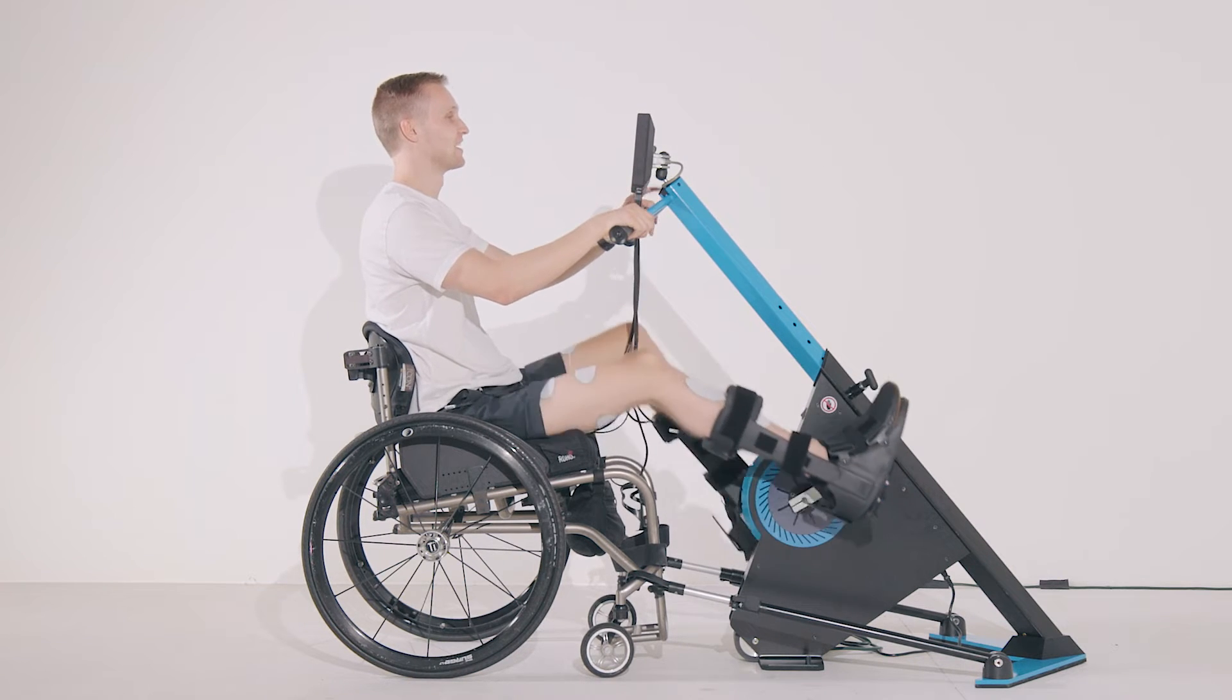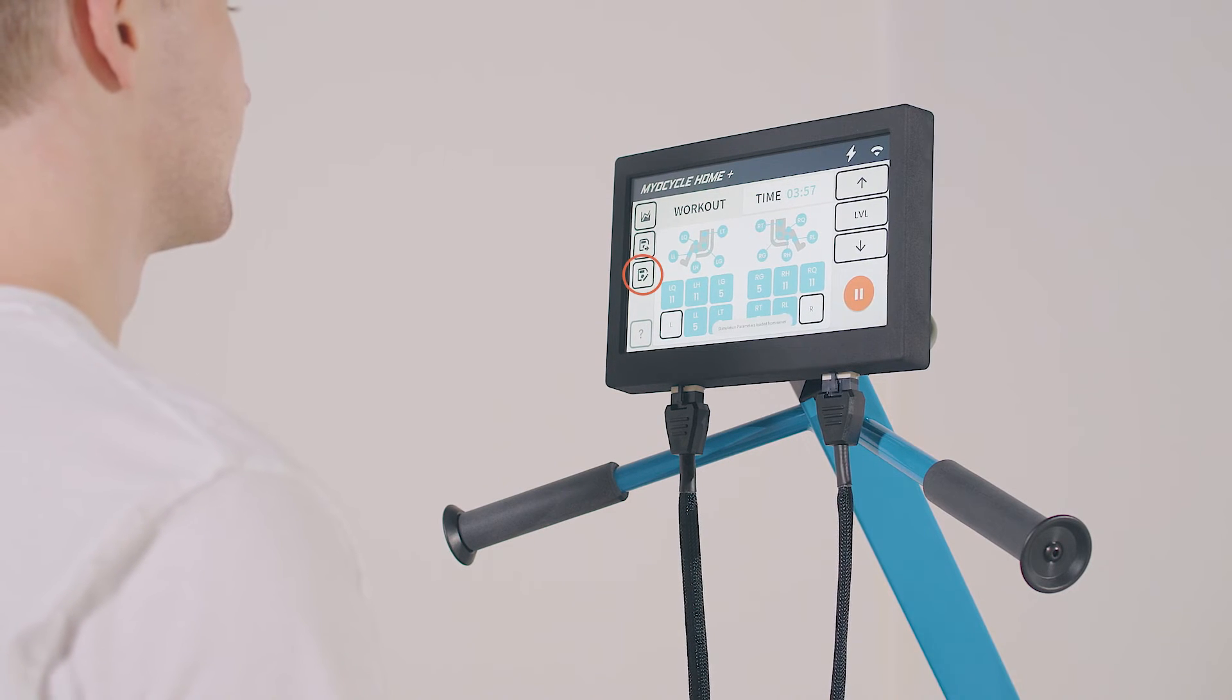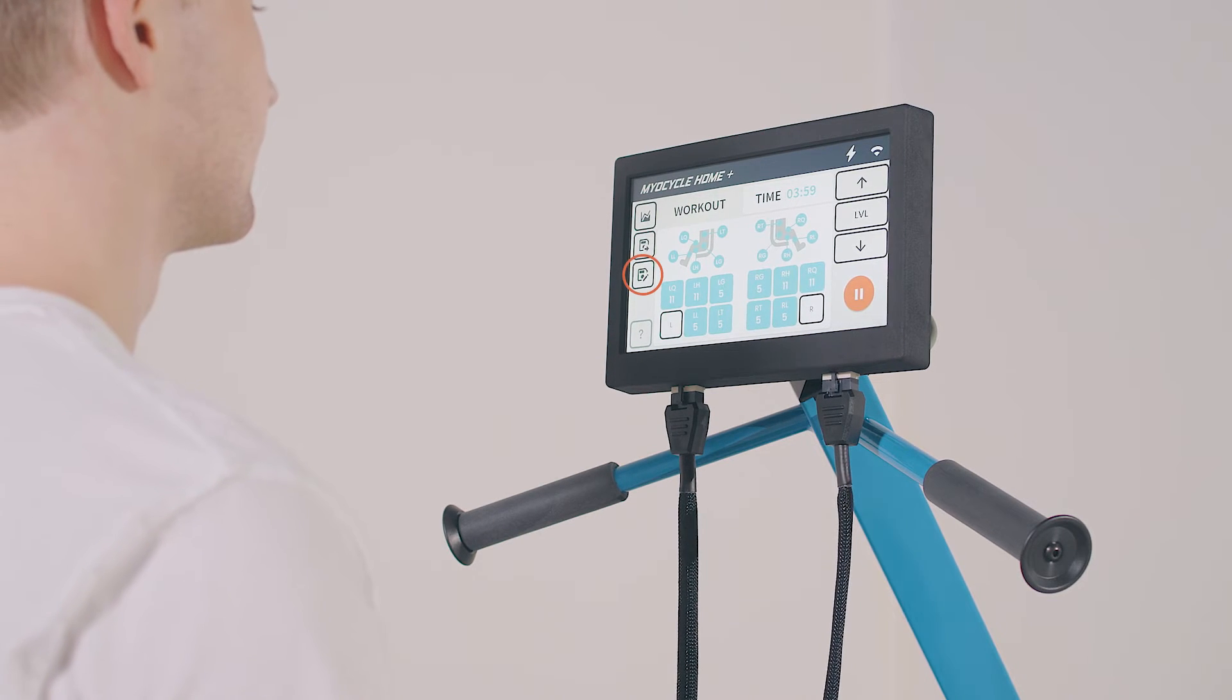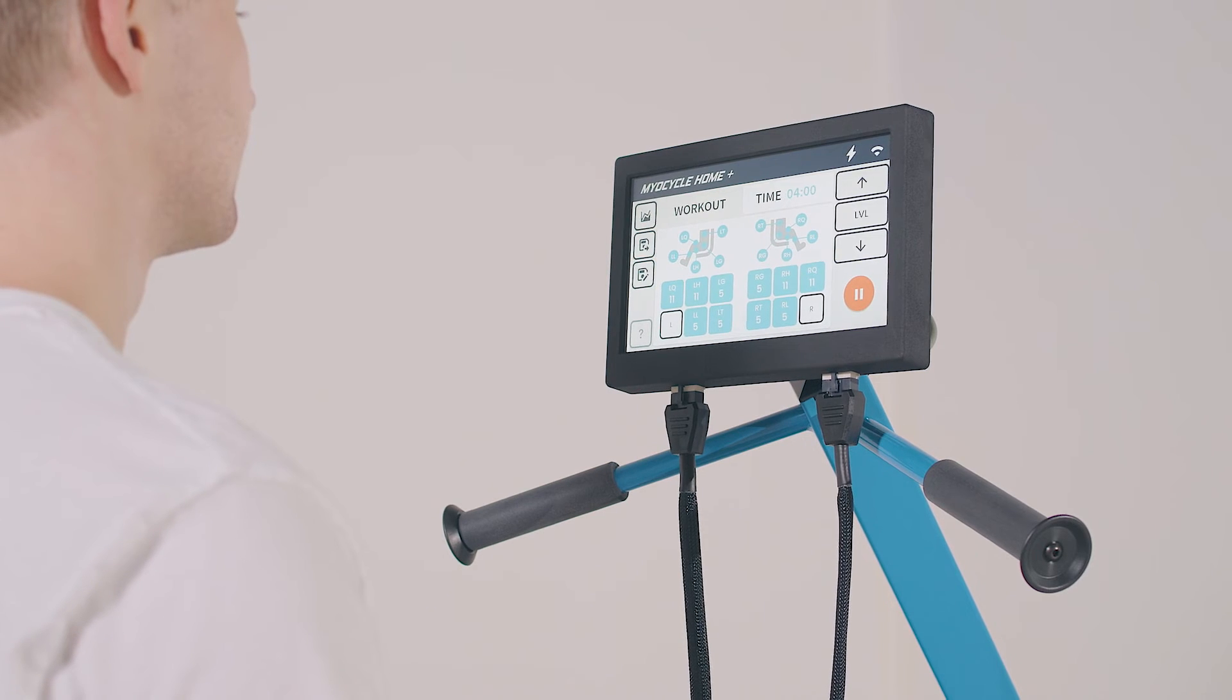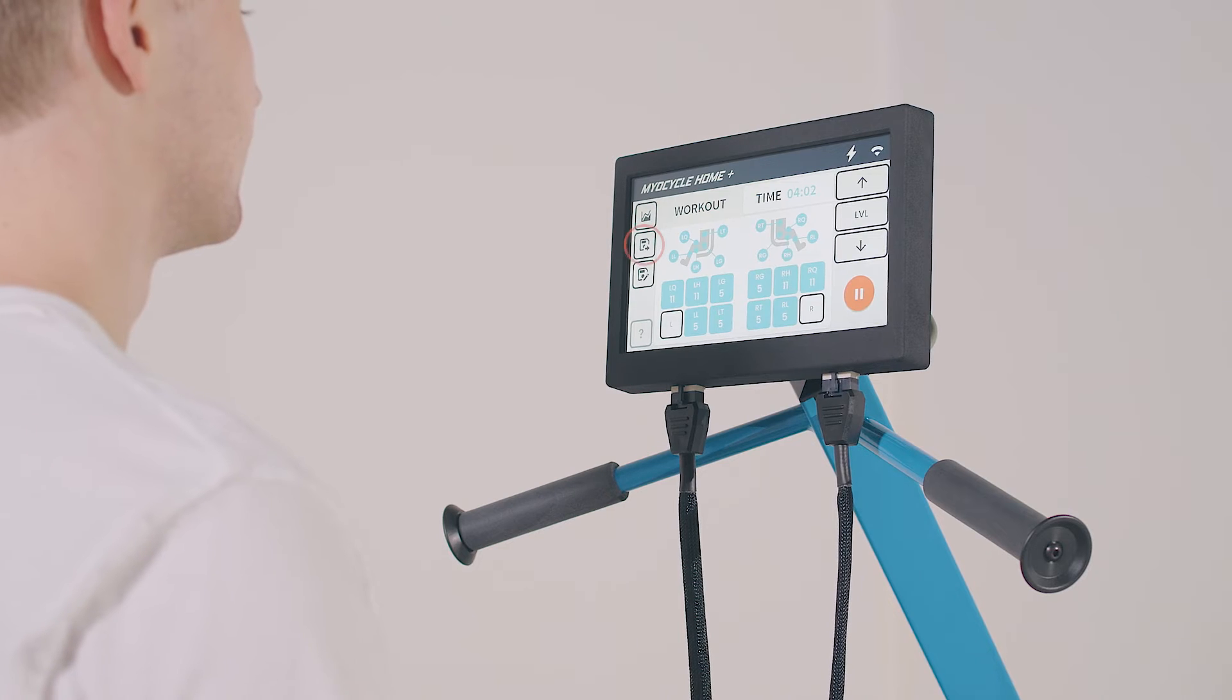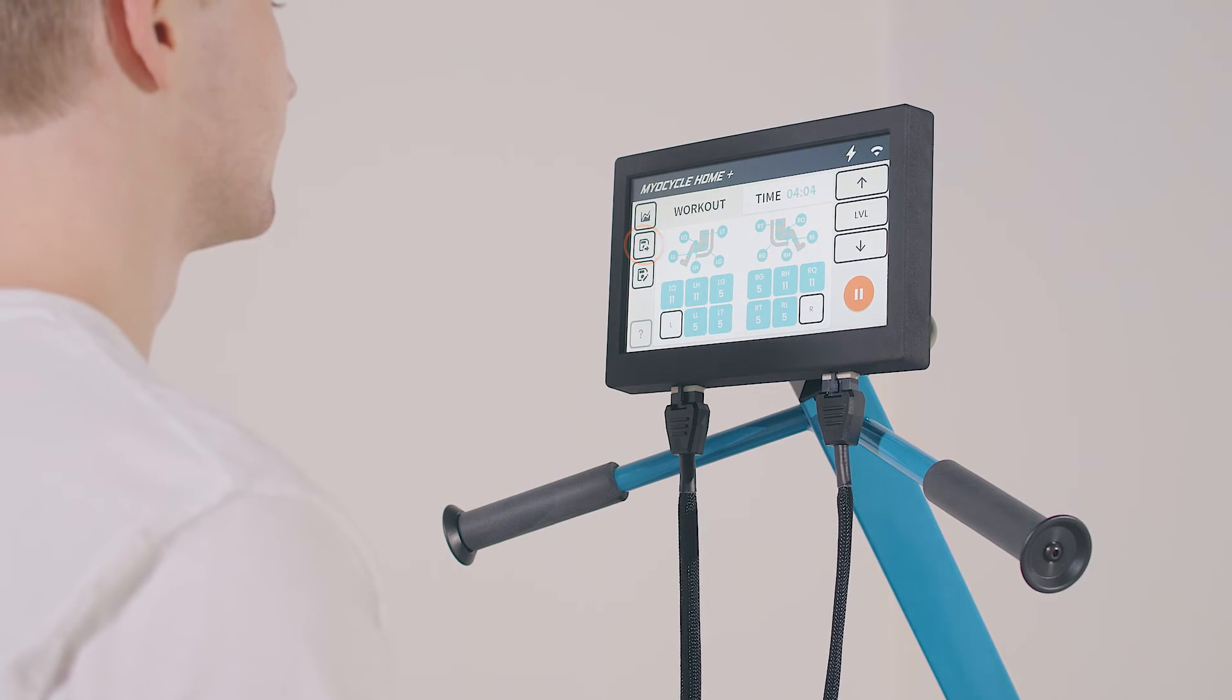The myocycle also features a preset function that allows you to save the current stimulation settings by tapping the floppy disk with pin button. Later, if you change the settings and want to revert back, or when you start your next session, you can easily load your presets anytime by tapping the floppy disk with arrow button. This will set all the channels to the stimulation settings stored in your presets.